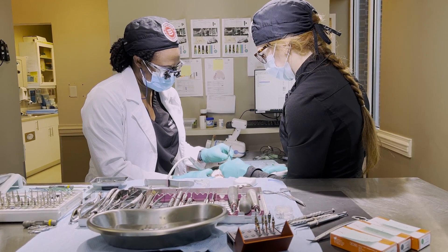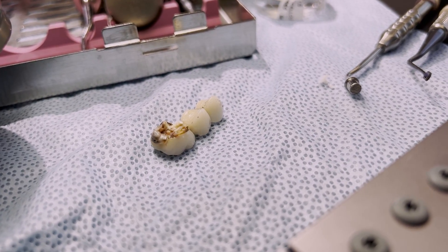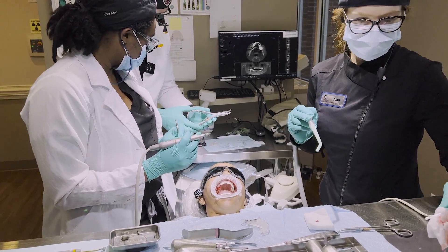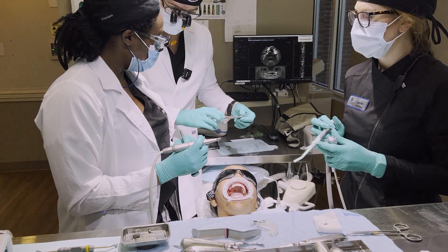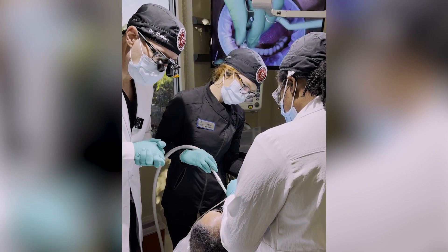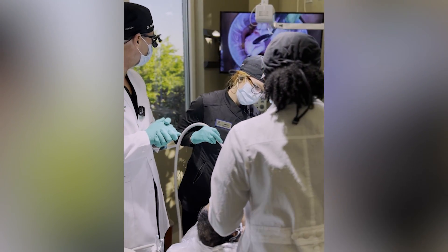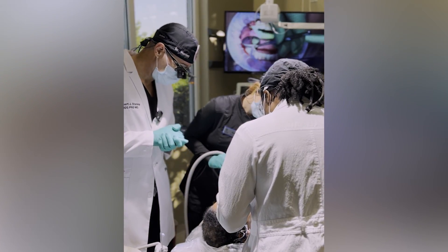We're separating the bridge. We were able to get the three-unit bridge out, and as you can see, it retained the crown, so we're going to go ahead and section the roots. This is our double-action rongeur — it's got a mechanical advantage, it's really, really nice. When teeth are root canaled, they come out in little pieces. This is typical. Is that all three of them? Yeah.